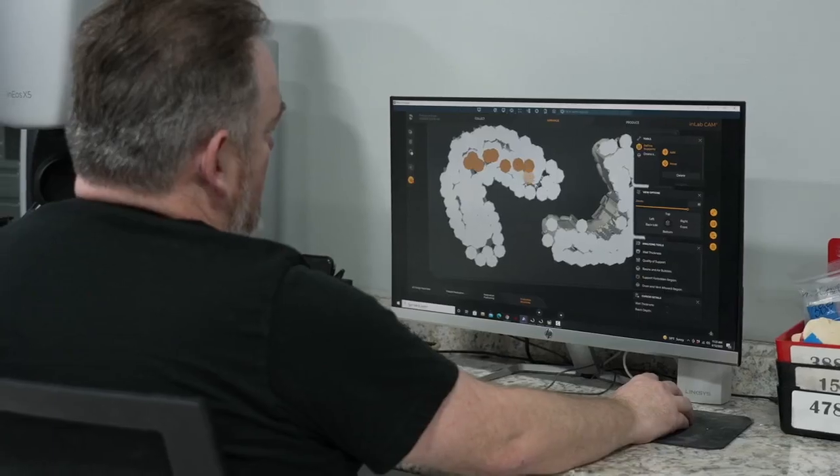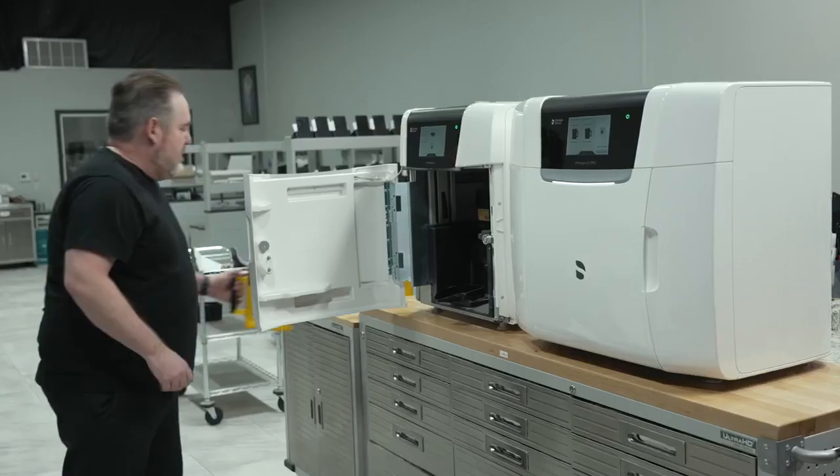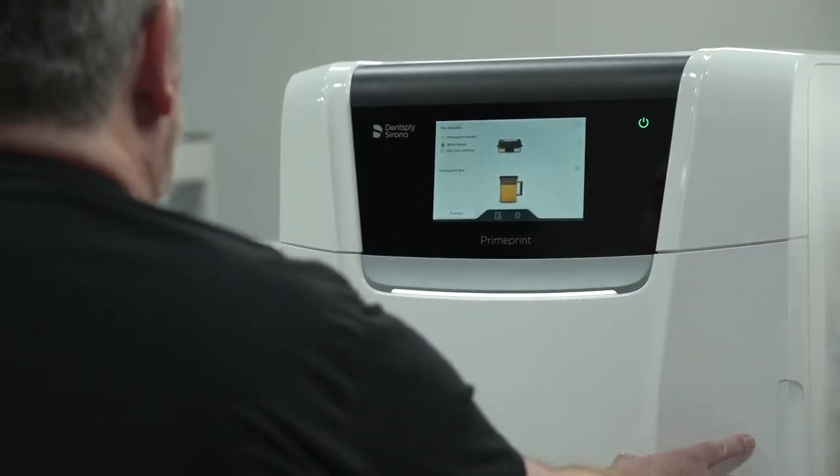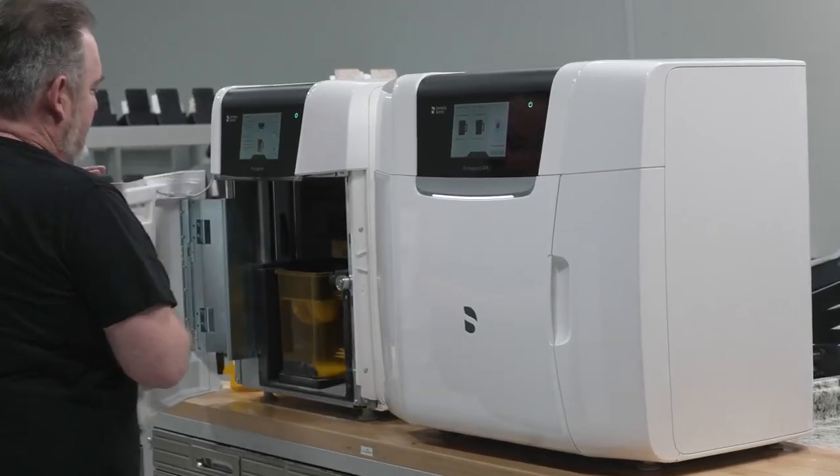I love the speed of the Prime Print, but I also love the ability to modify and personalize it in whatever way you want, especially in the software. The Prime Print to me is just the final piece of the puzzle. I've been waiting a long time for in-lab to bring me a printer that would complete my workflow circle — from my doctors with their Prime scans, into in-lab, out to my CAM, to my mills, and finally to my printer. When it comes to Dentsply Sirona's digital workflow, it all just works.